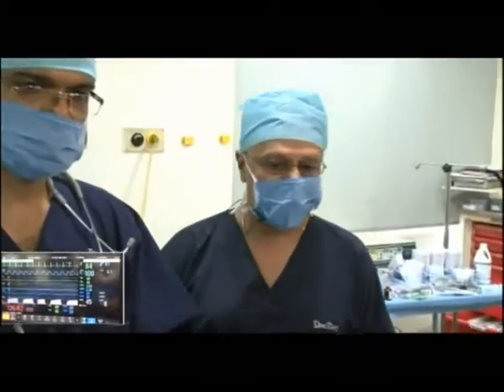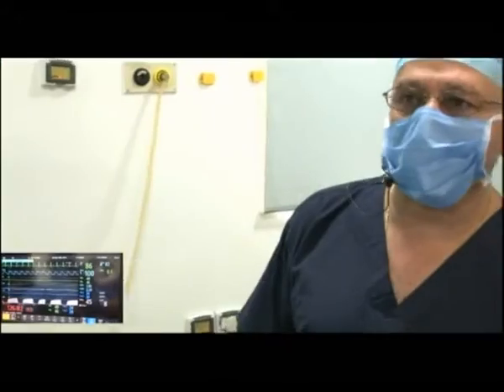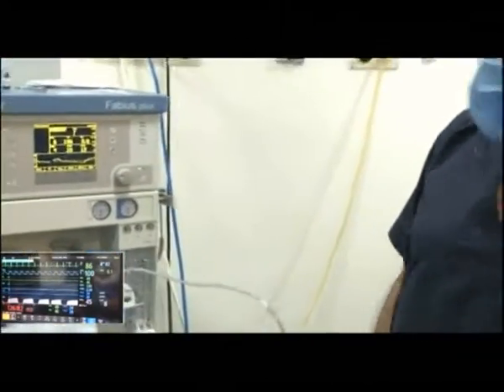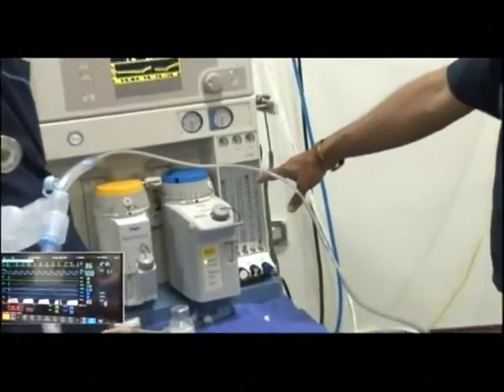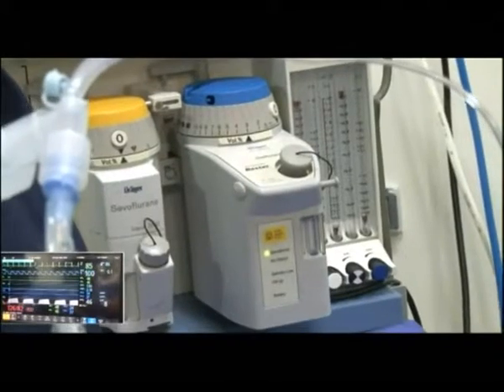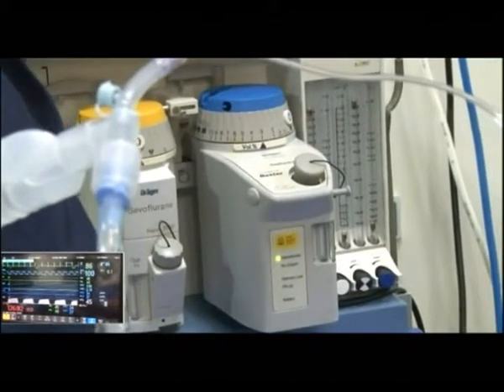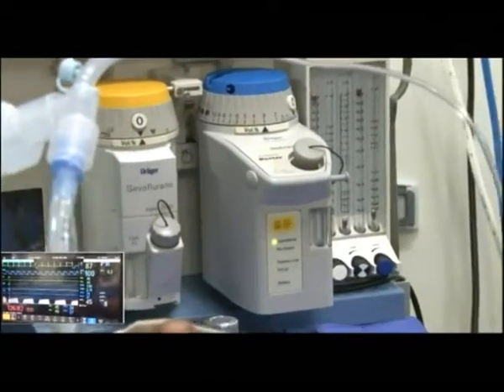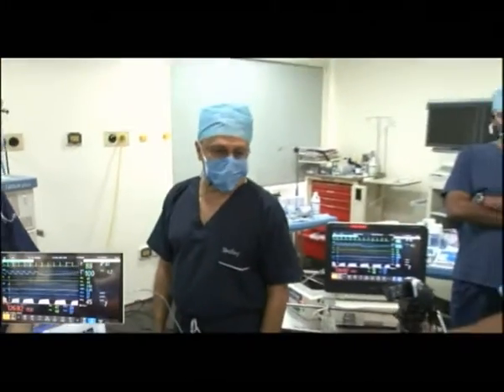Are you using low flows? Yes, we're using, actually, by definition, low flow is less than 1 liter total, or even less, maybe 500, but right now we're using 1 liter total low flows. I could easily go down, but that's what we're using, 1 liter. So relatively low flows, not the physiological low flow, which would be about 250, 300 mL. But we are using low flow easy, yes.